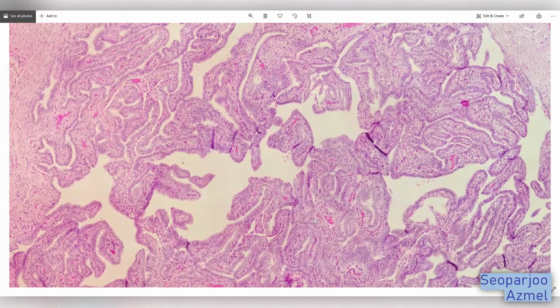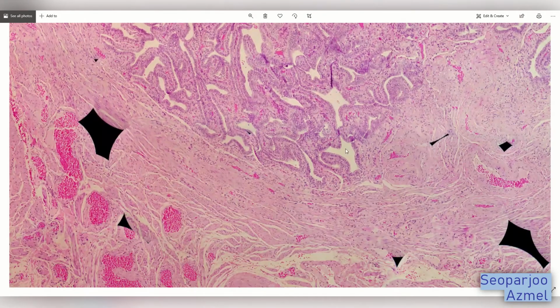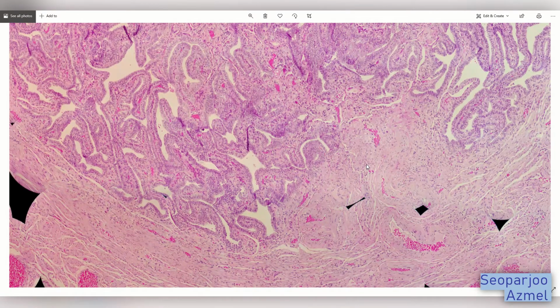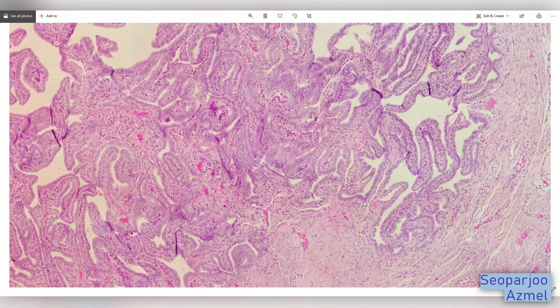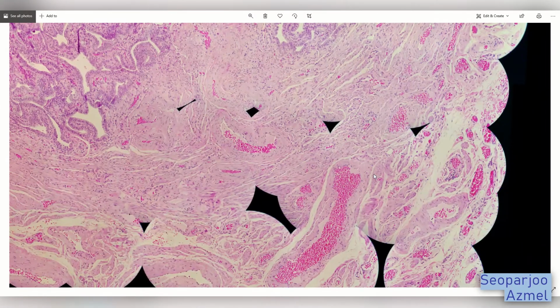They're almost the same. So yeah, it's a good thing to explore, and it might help you in teaching and also learning, using whatever you have around you.